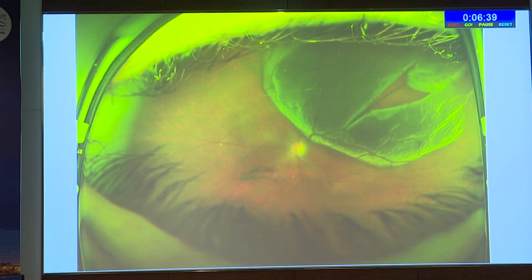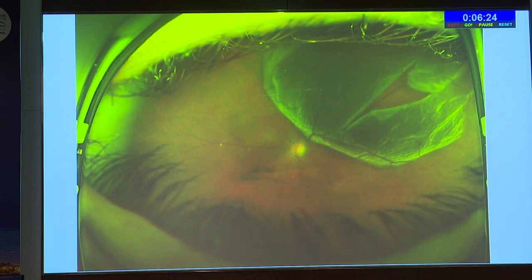Now, whenever lesions are highly elevated, especially in the periphery, you cannot document this with any technology other than ultra wide field imaging. The depth of resolution which you need you will get only with the panoramic view.